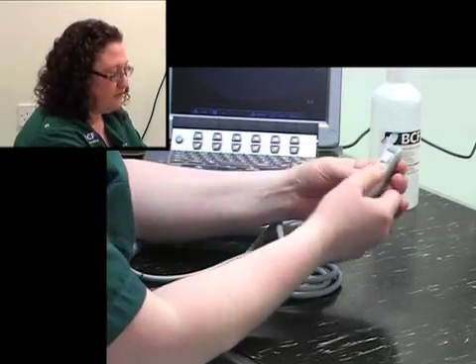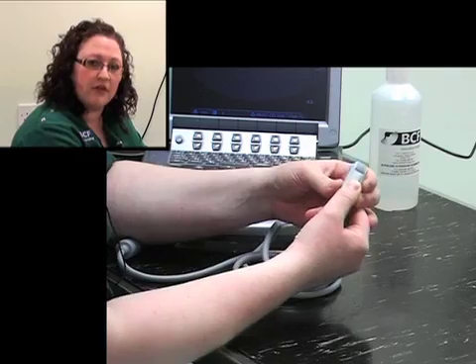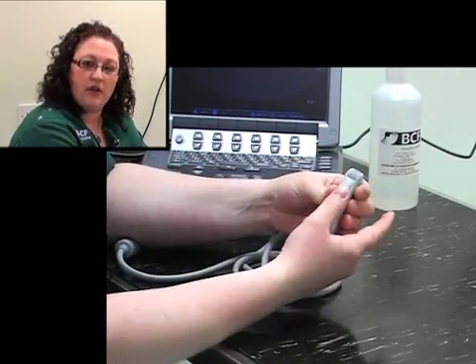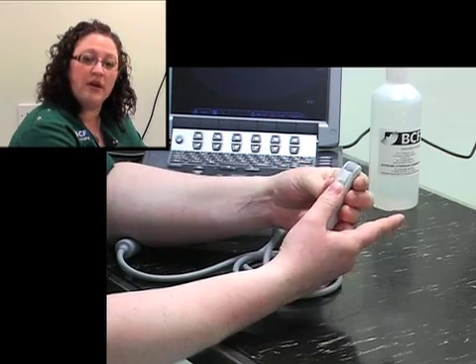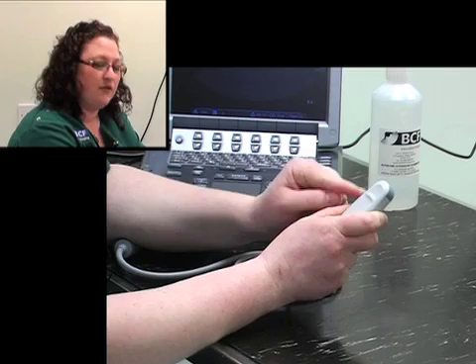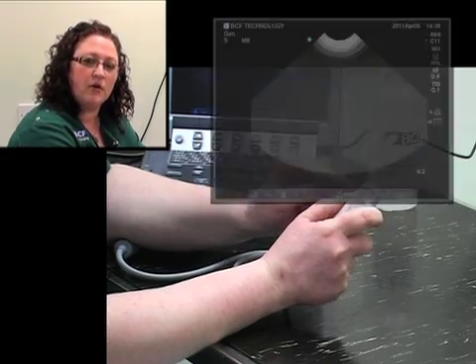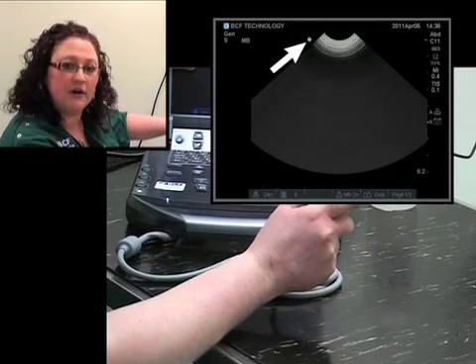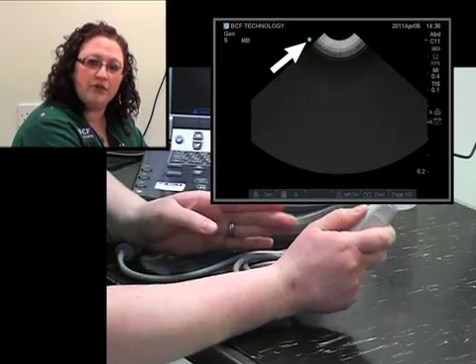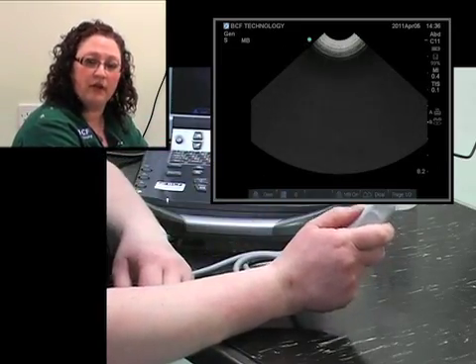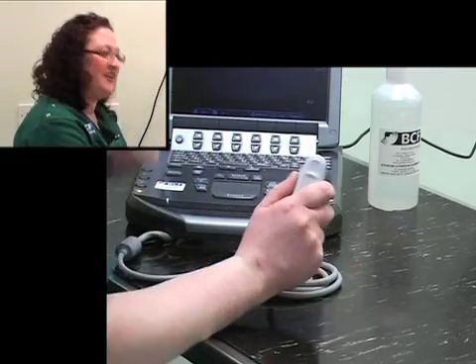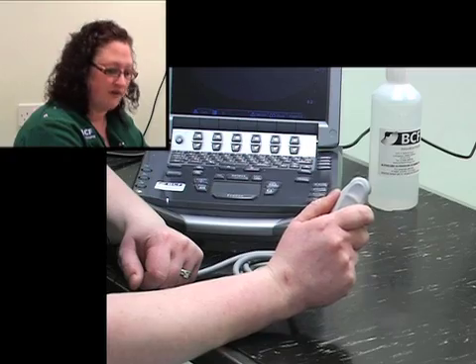There's one particular feature that we need to note about the probe itself, and that's this marker just here. In this particular probe, it has a finger notch along the surface. The reason this is important is because it corresponds to a blue dot on the monitor of the machine itself. This will help you to orientate the image when you're actually performing the ultrasound examination so that you don't have to keep looking at the dog and looking at the screen. You can know exactly where you are at all times.